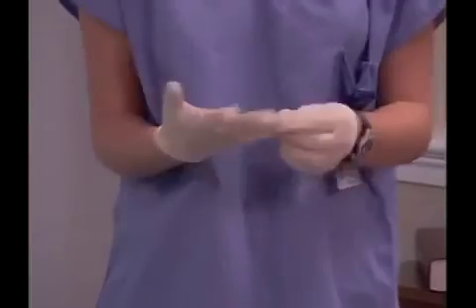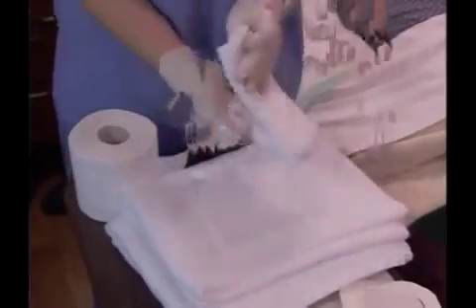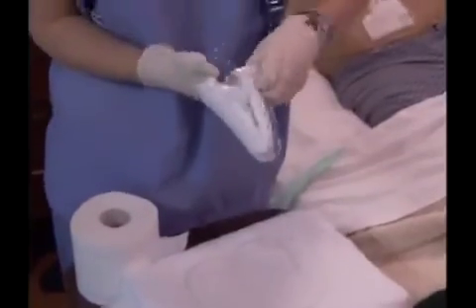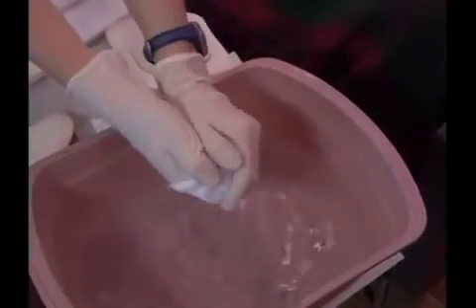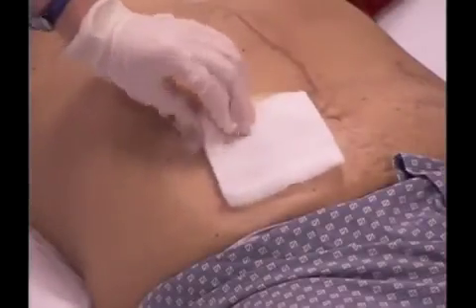Put on a clean pair of gloves. Form a mitt around your hand with one of the washcloths. Wet the mitt with warm, clean water and apply soap or other cleansing agent. Remove the gauze pad from the stoma and dispose of it in a facility-approved waste container.